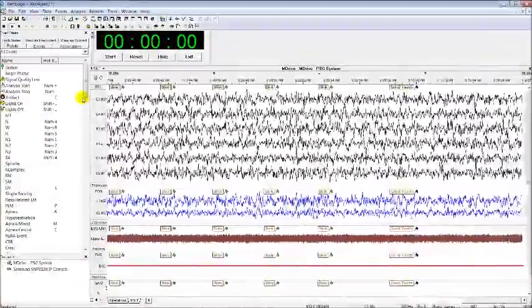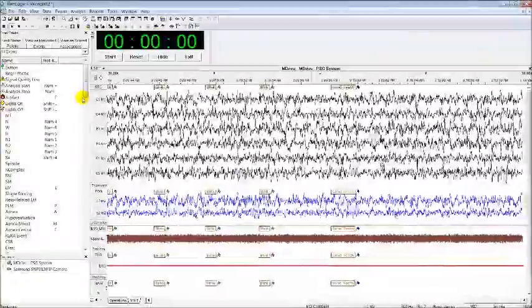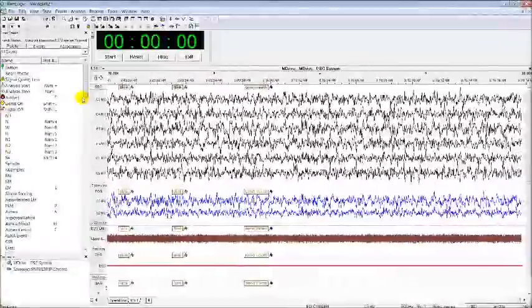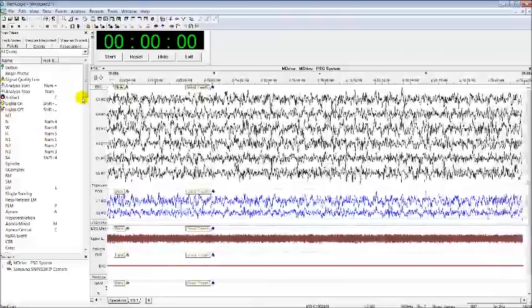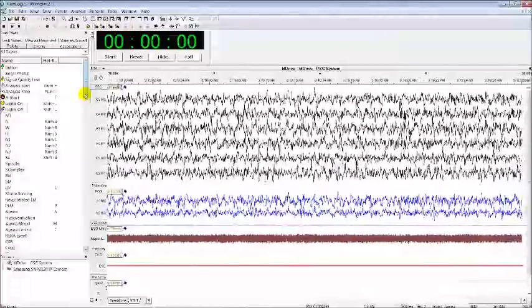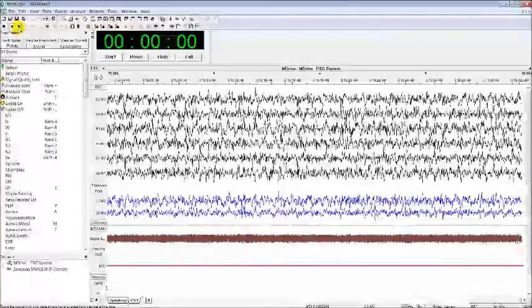Okay, and then this is the part where we will ask the patient to lie down quietly and try to fall asleep. And do remember that the instructions for the patient should be standardized for all the naps. Before we start the nap or put the lights off, this is the setting that I would like to do. First, I will change it to real-time interval.